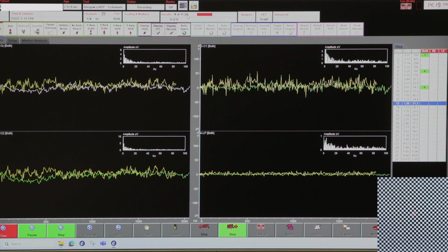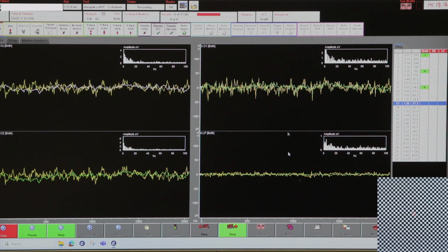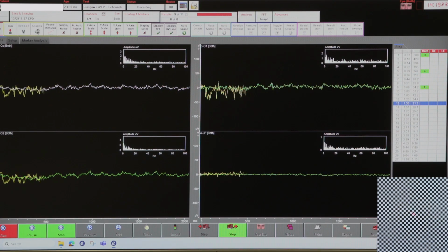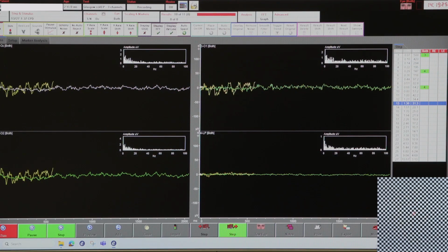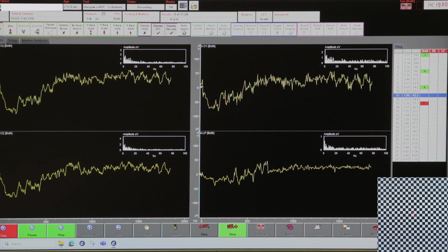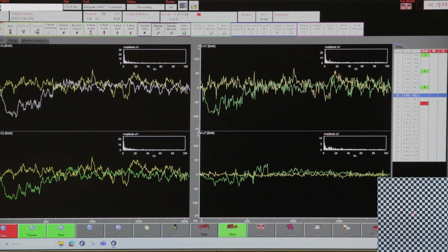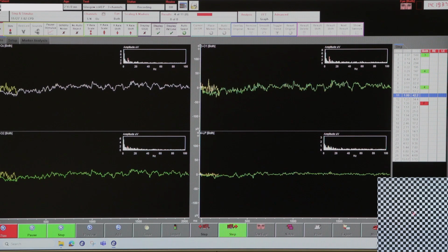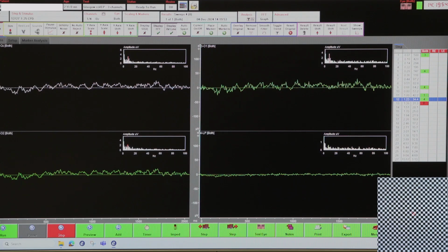We're performing two different analyses on each channel. Firstly, seeking a critical signal-to-noise ratio, and secondly, undertaking circular T-squared tests, which look for vector clusters which exclude the origin. No VEP was detected there, so it's 2 steps back up the staircase. Remember, we're seeking green, green, red for consecutive check sizes getting smaller. That's now achieved, so the test is finished. That one took just 90 seconds total recording time because not too many check sizes were needed.